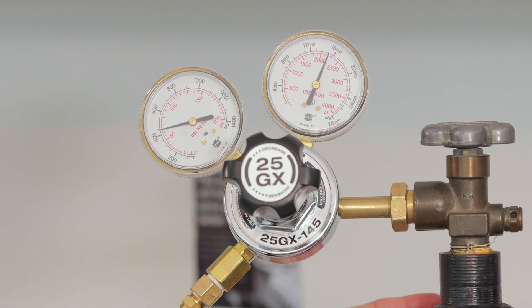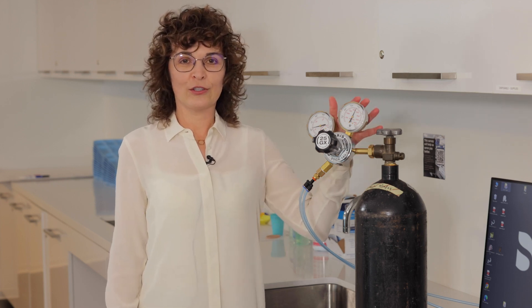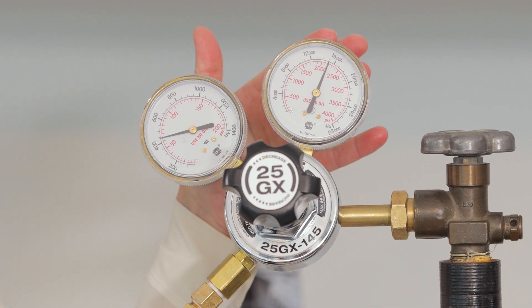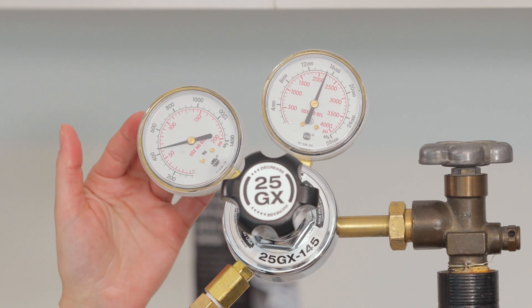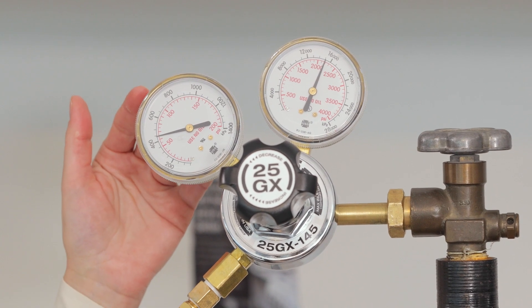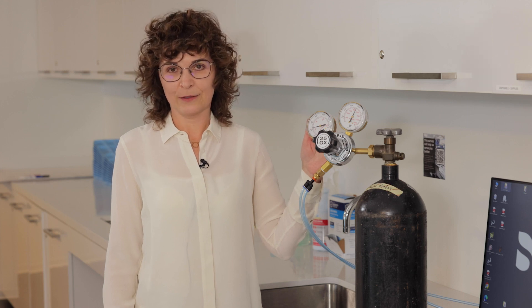This is a common setup of a nitrogen tank and a regulator. Please notice the regulator has two gauges. The gauge on the right shows how much gas is present in the tank, and the gauge on the left shows the pressure of gas that is being dispensed into the post-processing unit, or the PPU, during the curing cycle.